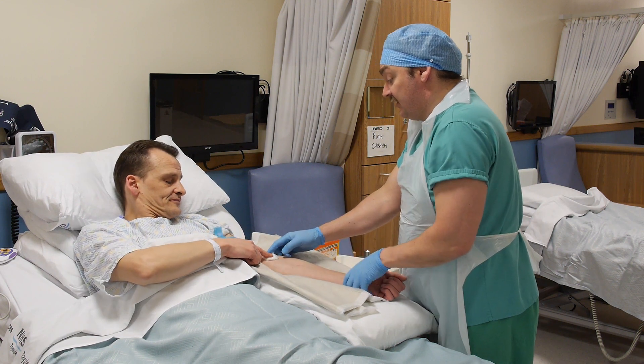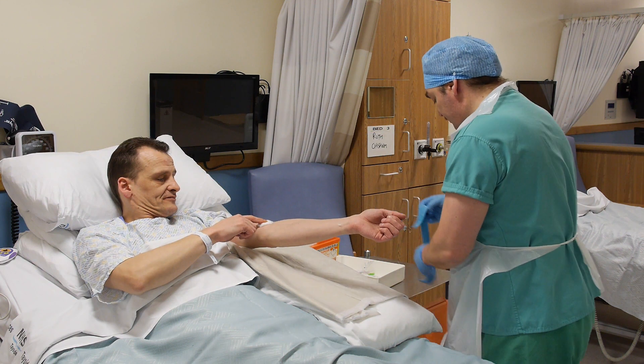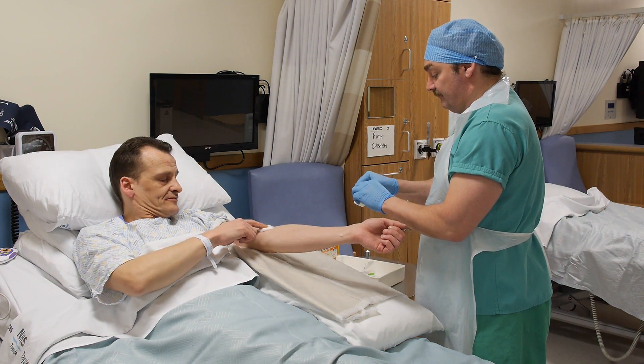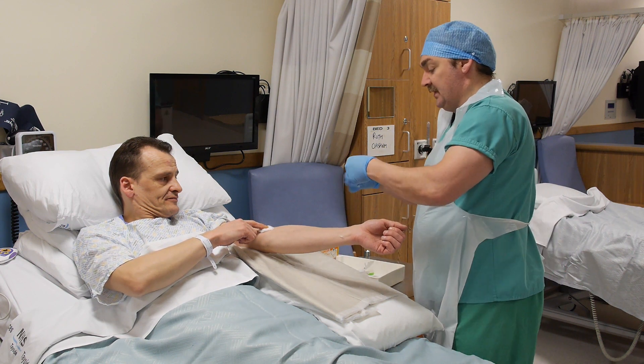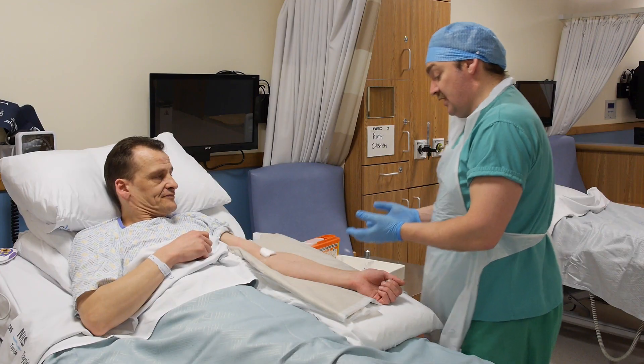Apply digital pressure over the puncture site until bleeding has ceased; this will take approximately one minute. The patient may do this, but don't allow them to bend their arm. Once the puncture site is sealed, cover with an adhesive dressing and ensure the patient is comfortable.